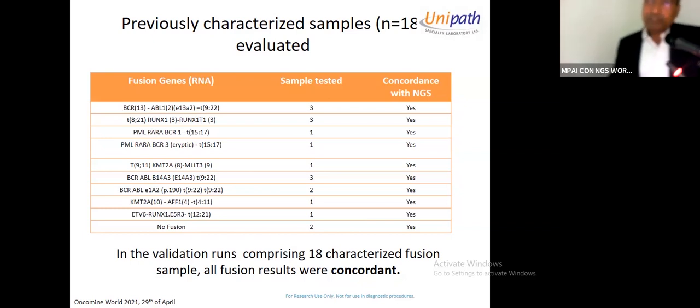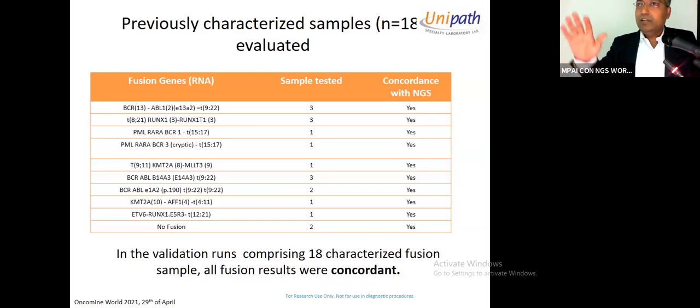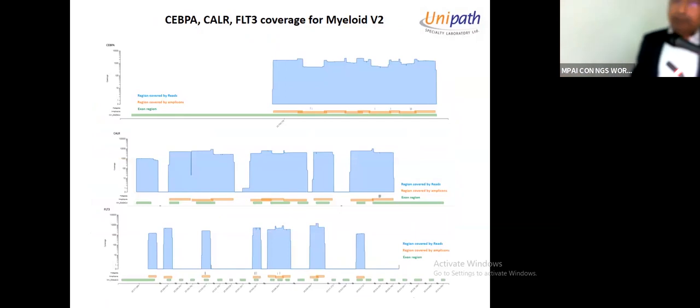It also happens sometimes that there are false positives being created in the run. So you have to have your assay defined very well. Getting 500, 600 reads of many fusions in a run is not possible. So you have to see whether your run quality is good. Retesting it with another protocol and repeating the run is very, very helpful. And we see that there are mistakes happening in that area.